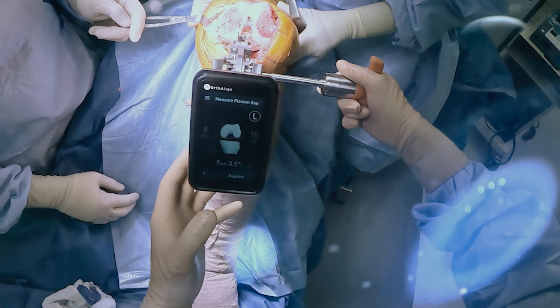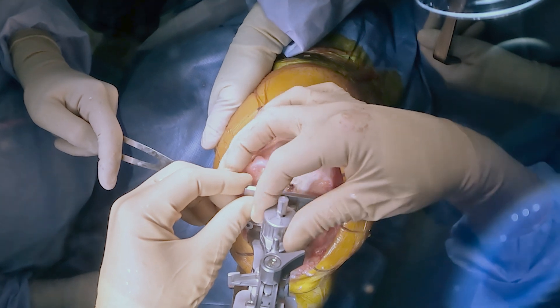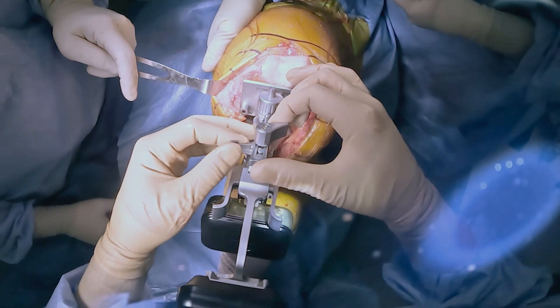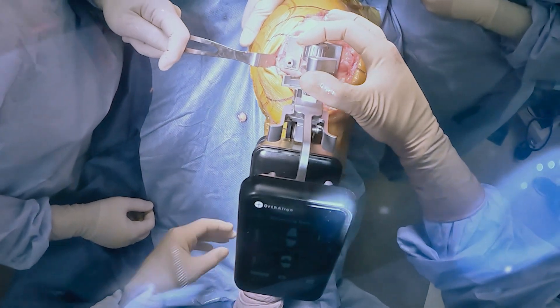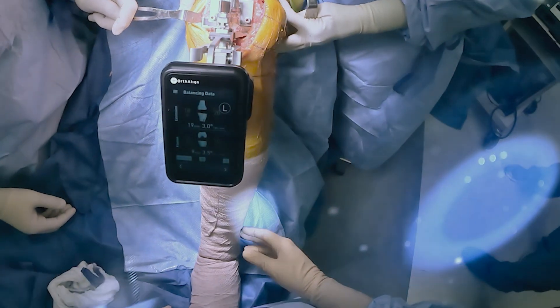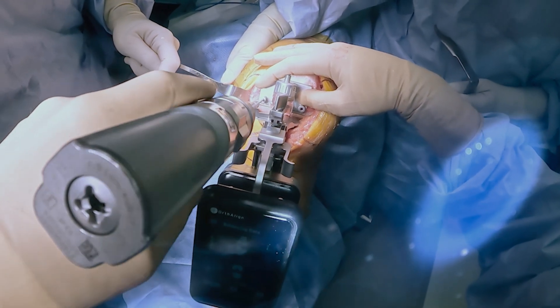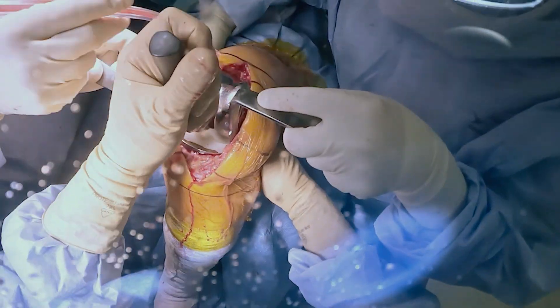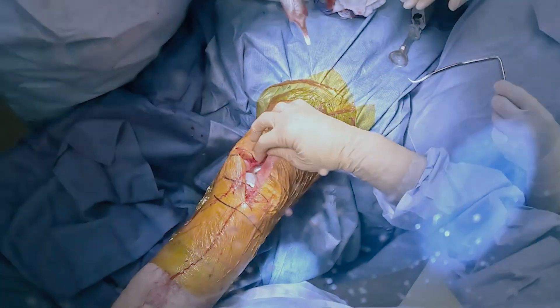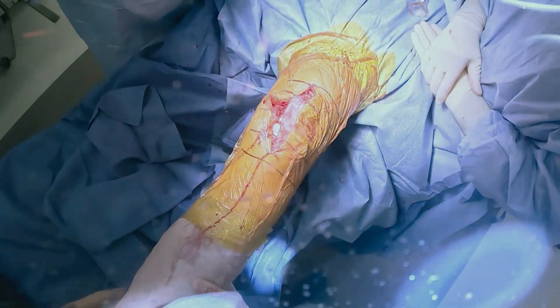Here we are setting our flexion gap. We just created a rectangular space, which is parallel to the tibial cut. And once we have determined the appropriate depth of resection, we're using pins into an implant specific drill plate, which is unique to each manufacturer. This gives us the luxury of being able to use any implants with this system because it's an open platform, and it allows you to not be bound either in an ASC or hospital setting. At this point, we're finishing the case by impacting the polyethylene and getting our final checks with varus valgus stress at 0, 30, as well as checking anterior to posterior stability with 90 degrees of flexion.